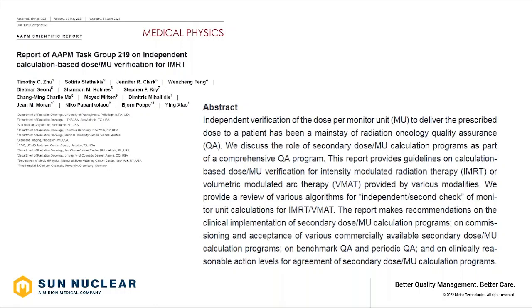So it does touch on several important topics. Among them, it discusses the limitations of dose and MU verification software programs. It talks about how dose and MU verification programs can complement measurements for IMRT QA, as well as how to perform acceptance and commissioning of such programs as well.